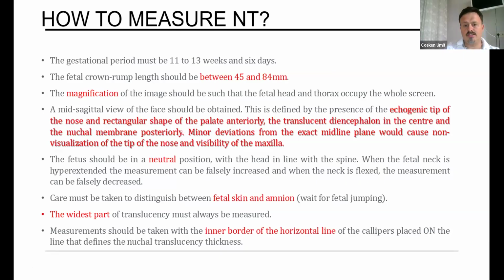Minor deviations from the exact midline plane would cause non-visualization of the tip of the nose and visibility of the maxilla. Neutral position is very important.